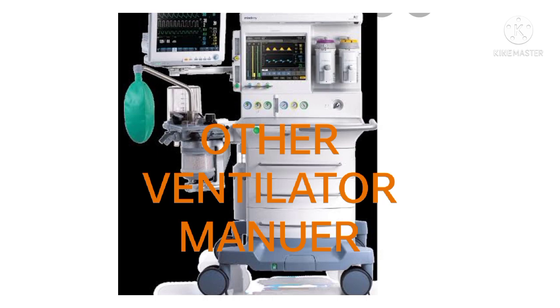Bi-level positive airway pressure, BiPAP, provides 2 levels of positive pressure support, higher inspiratory positive airway pressure and lower expiratory positive airway pressure. It is a non-invasive modality and is delivered through a tight-fitting face mask, nasal mask, or nasal pillows. The patient must be able to spontaneously breathe and cooperate with this treatment.